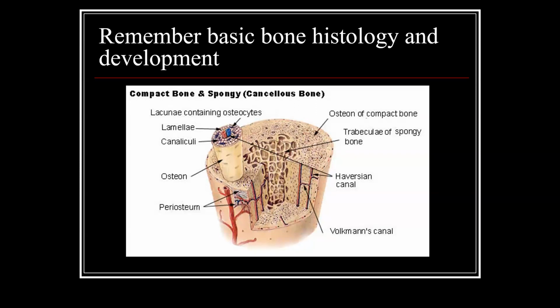In a juvenile individual, the osteons will have well-organized lamellar bone, but there will be intervening areas where you see more primary bone that has been endochondrally ossified and so forth without this secondary lamellar bone reorganization. So that can be a helpful thing in terms of dating the age of a biopsy and so forth. And sometimes that's important when you're looking at something that may have been mixed up with someone else and so forth.